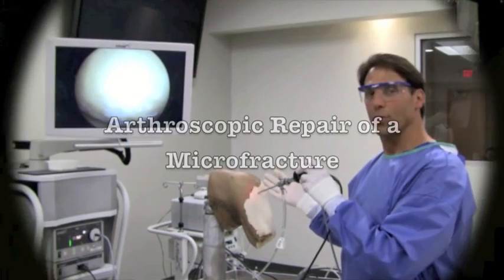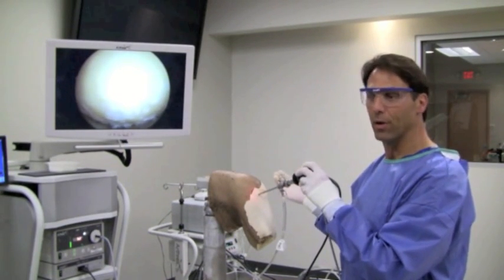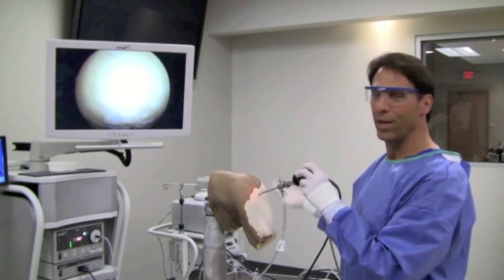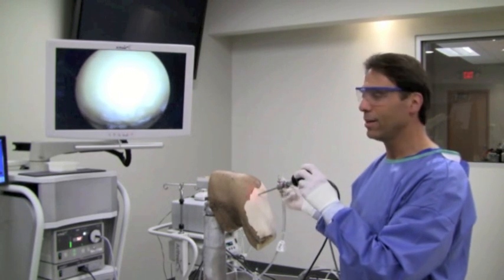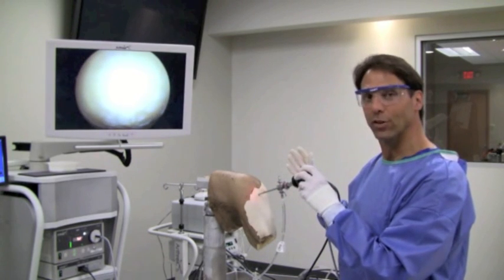So now we're going to the arthroscopic procedure. I'm going to show you one more thing. This is the microfracture. If anybody picks up the sports page of your local newspaper, it's going to talk about the latest NBA player who's had a microfracture of the knee. It's a long word. I know not a lot of people understand what it is. So I'm going to show you what a microfracture is.